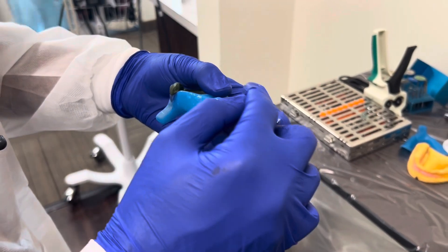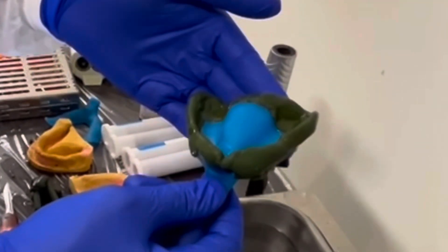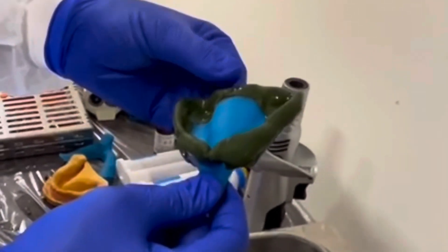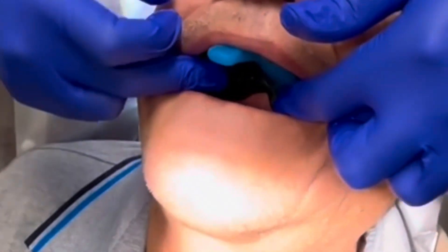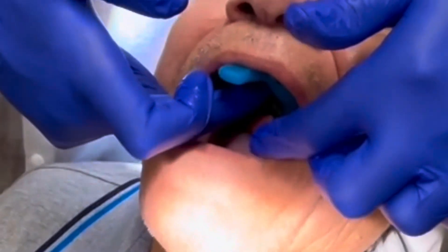The process is then repeated on the other side. Once we've been around the arch, I like to heat up the distal area of the tray and the distal buccal areas in the hot water bath and then seat them one last time, asking the patient to move their lower jaw left and right. That usually reinforces the posterior palatal seal and enhances retention.